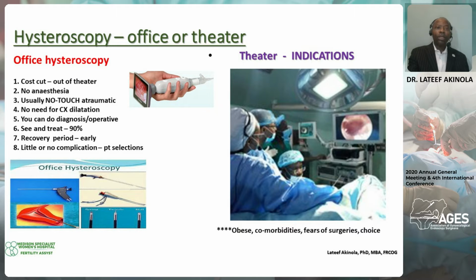You don't need to do cervical dilatation in most cases. You can do diagnosis, you can operate at the same time, and the recovery rate is very good, and the patients go home with little or no complications. Of course, when you have theater indications like obese patients, patients with comorbidities or fear of surgery, the patient may decide not to do it in the office. You need to oblige the patient as well.